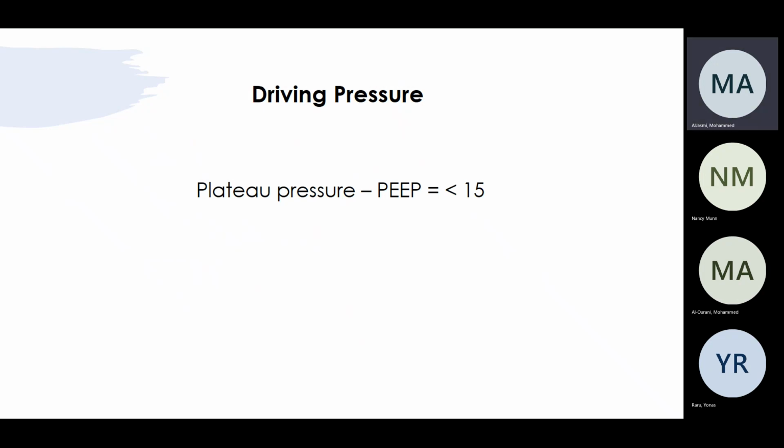So what does that question mean? If I have an ARDS patient, and I put him on 10 of PEEP and 400 of tidal volume, and that's 6 ml per kg, and the patient is saturating like 92. And his peak pressure is 29. Okay, that's like a fantastic setup, is that right? We don't have high peak pressure, we don't have high plateau pressure. Would you like to change something in this patient or not?